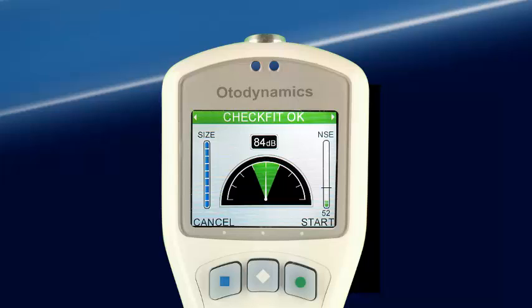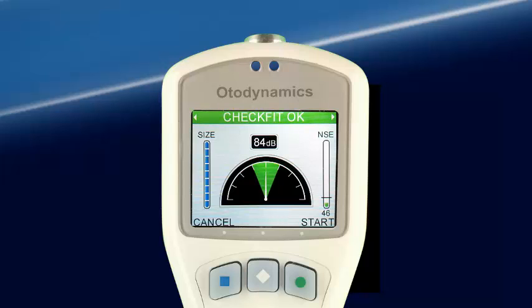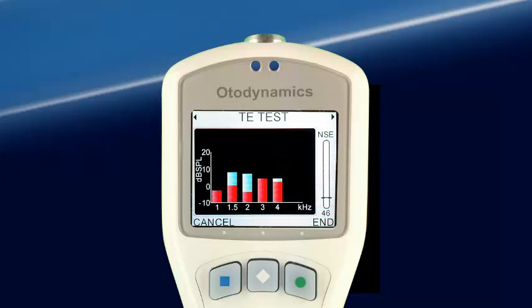CheckFit shows ear canal size on the left, the stimulus level in the ear canal in the center, and on the right, the noise bar and noise reject level indicators. Rejection of noisy samples is indicated in red on the noise bar. CheckFit will attempt to adjust the TE stimulus level in the ear canal. When the stimulus reaches the preset level, the test can begin automatically or by selecting Start, depending on the test settings.